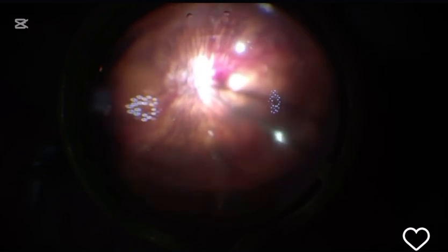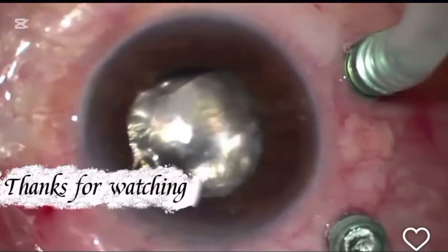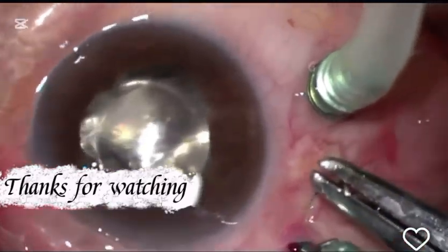And after finishing the endolaser, I will do FAX, fluid air exchange, by maximum vacuum using the cutter. And then if there is residual fluid, I will use the flute. And this is what I've done, using the flute needle to aspirate the residual fluid and the area of hemorrhage. As can be seen here, the flute is barely touching the surface. Now it's been left bright, kept on air, as the sclerotomies are sutured.